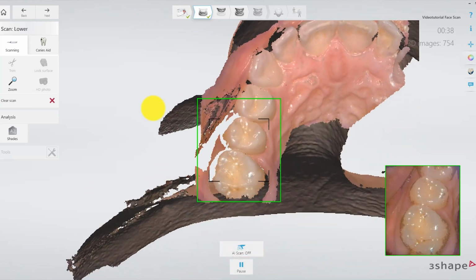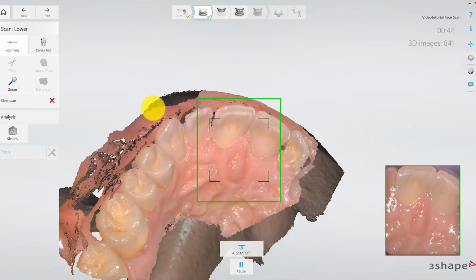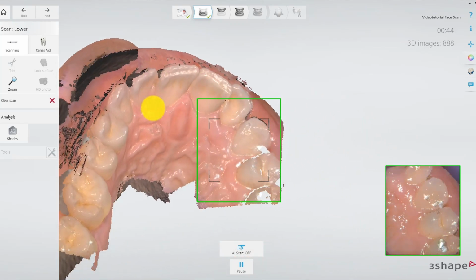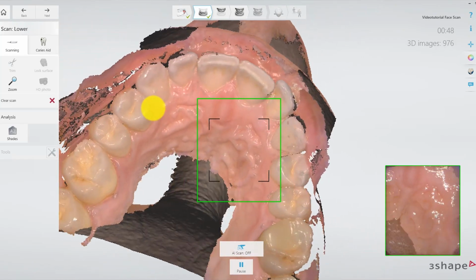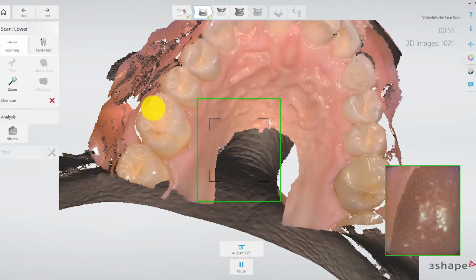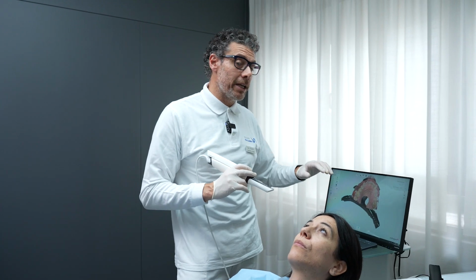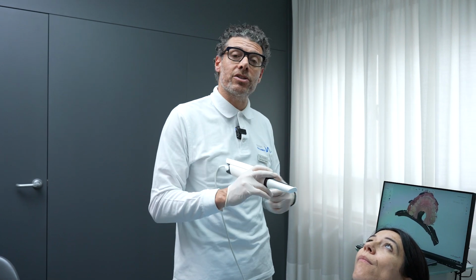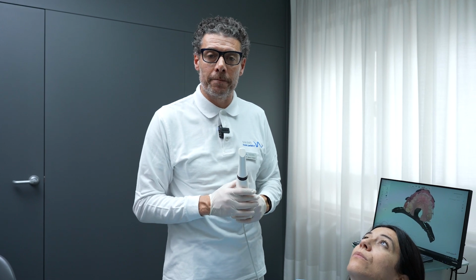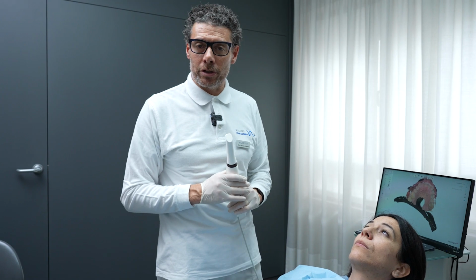And this, I would say, is the main difference with the techniques already published. The fact that we don't stop at the frontal area with incisors and canines, but we go further, to the posterior area. Why do we scan these posterior areas? These posterior areas are critical for the correct spatial positioning of the intraoral scans that will be aligned with the perioral scan. And you will also see this part well described in the lab video part by Laura.